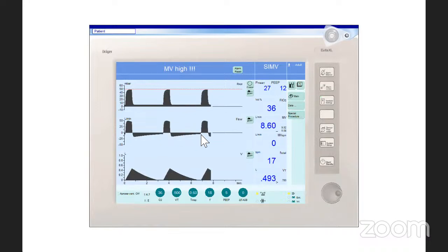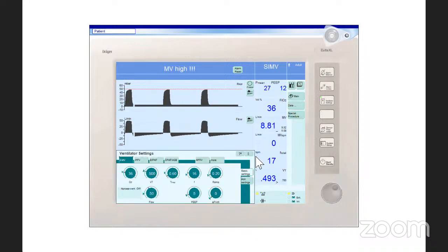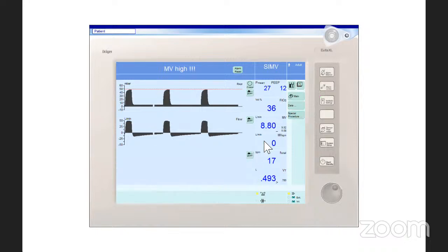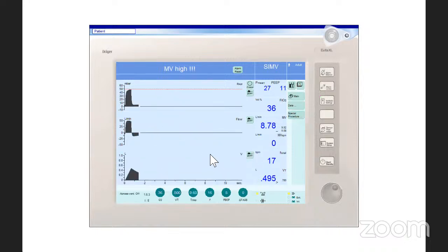So once you maximize the respiratory flow time for the patient, you would start thinking about decreasing the minute ventilation. At this time now, when we decrease the minute ventilation, it would affect the CO2. Any decrease in the rate or the tidal volume will translate into higher CO2. So we can go down on the rate to 16 and see what happens. Of course, the minute ventilation is supposed to go down. Here you need to probably repeat ABGs and see what happened to the CO2. You can see that we still have some auto-PEEP, but it's improved remarkably compared to previous.